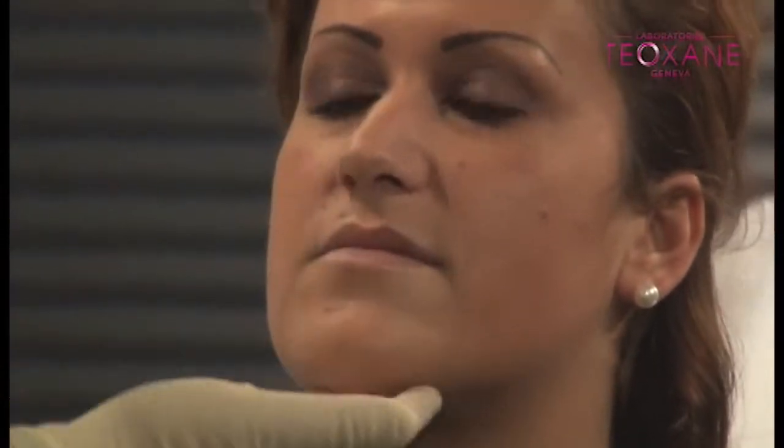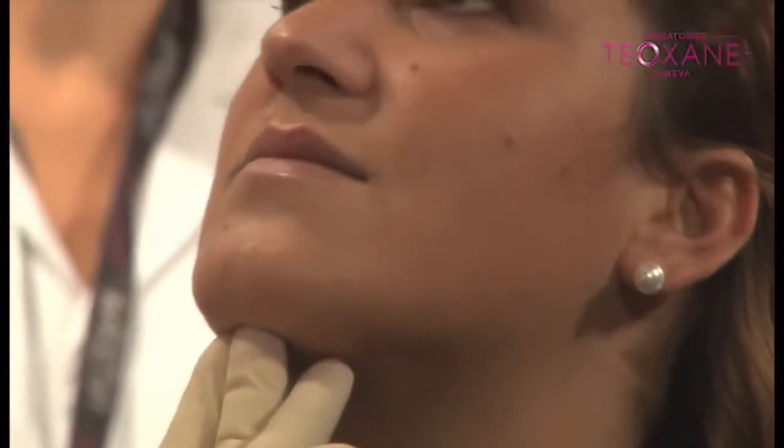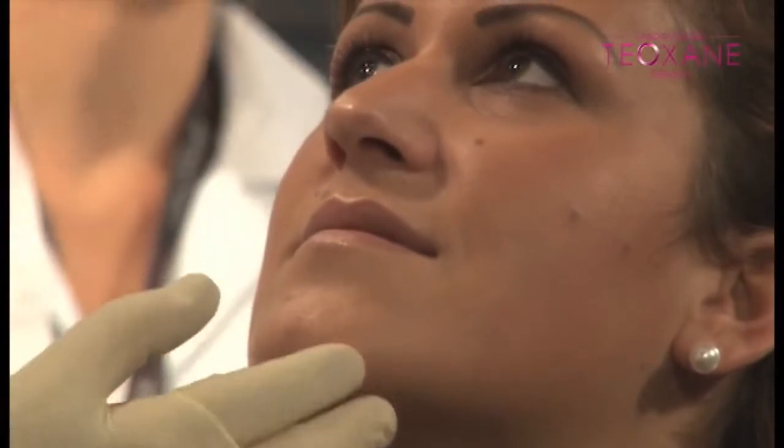We're going to do the nasolabial fold at the same time. Smile — see, when she has a smile, it's nice. Subtle improvement. I'm going to show you a different technique for the outline — a nice little smile.